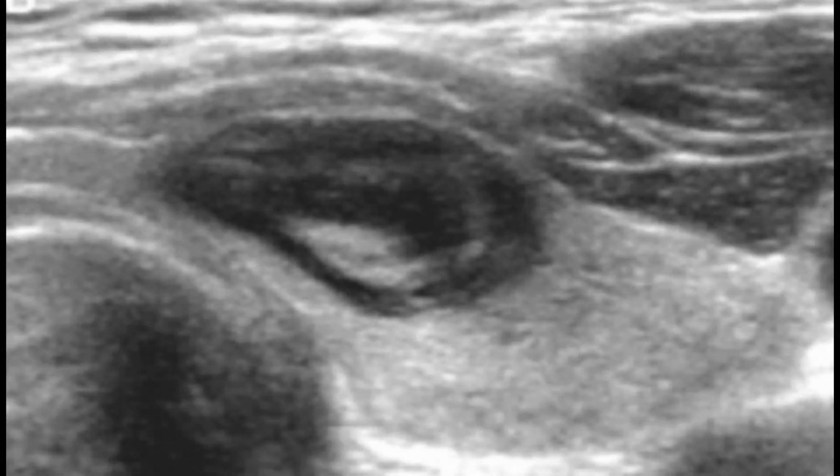For better understanding, here is another U3 classification nodule in front of you. Look, this is the left lobe of the thyroid, and here you can appreciate a hypoechoic lesion, and within the hypoechoic lesion you can appreciate cystic changes. There may be calcific foci within it, or there may be cystic changes, or sometimes you may see both calcification and cystic changes together. So this is a U3 nodule.